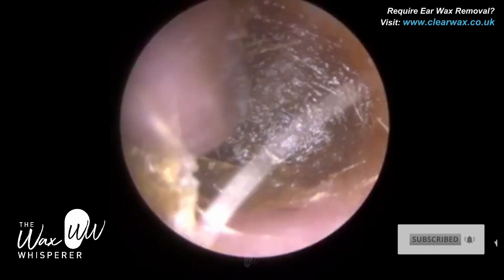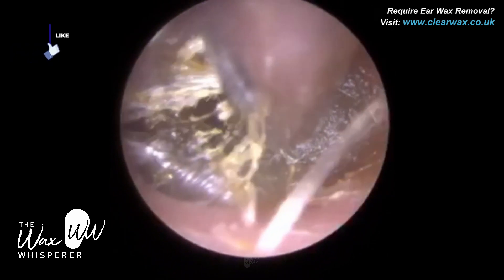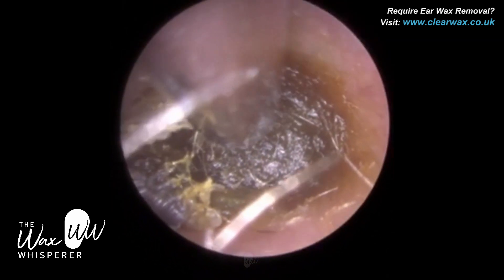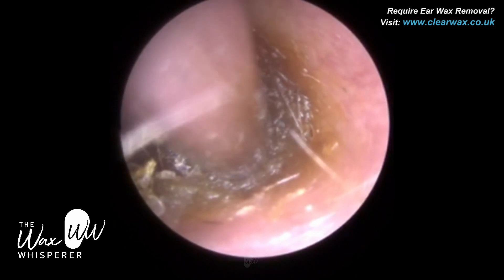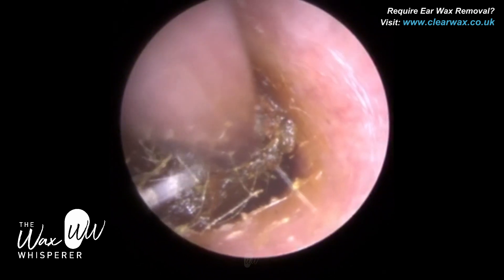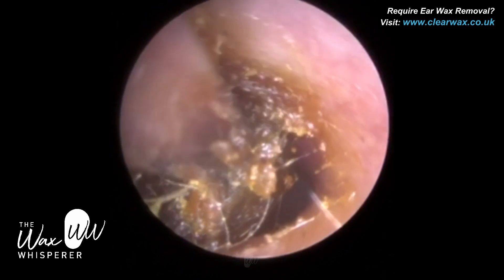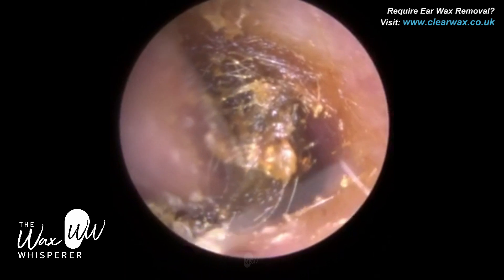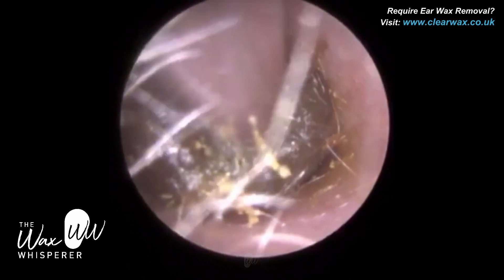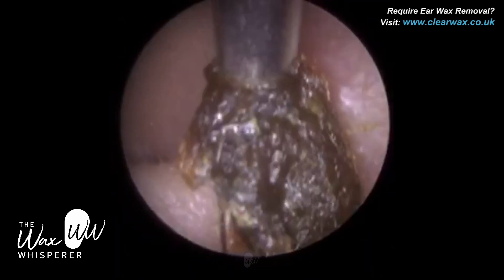The client attended with bilateral impacted earwax. When we say impacted, we mean that the wax has been lodged — it's been pushed really deep into the ear. I always compare impacted earwax to sand in a bucket when you're on the beach: you've got the spade, you're putting wet sand into the bucket and hammering it in. That's what happens with earwax when you use Q-tips or cotton buds, the majority of the time. This had been impacting both sides, and you could probably see the indentation of the cotton bud.